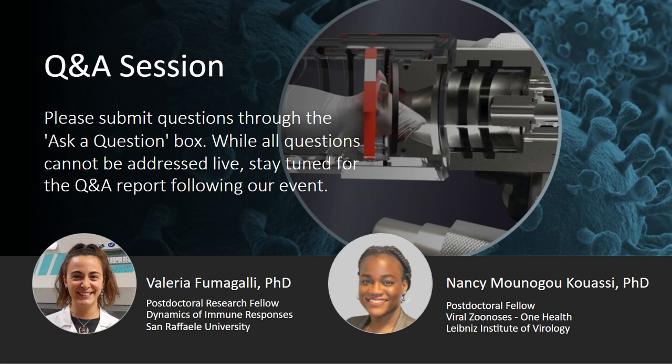And about the acclimation process, the mice are very quiet. They stay well, I think, because after about 10 minutes they do not move anymore. We put the tower inside the hood because we are using SARS-CoV-2. And what I did was to switch off the light in order to acclimate the mice better.